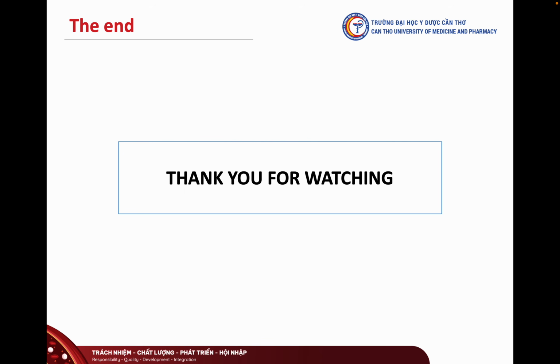Okay, now let's wrap up with a few key takeaways from these lessons. In summary, remember to check the hemoglobin to confirm the presence of anemia. Then, the MCV as well as the MCH help us to categorize the type of anemia based on the size and the hemoglobin content of the red blood cells. And this overall approach gives us a broad understanding of the anemia nature and helps to guide further investigation.